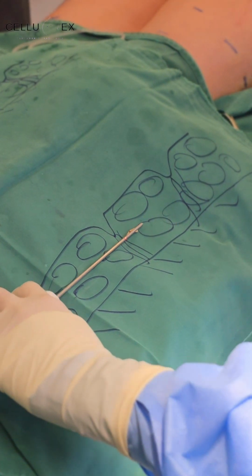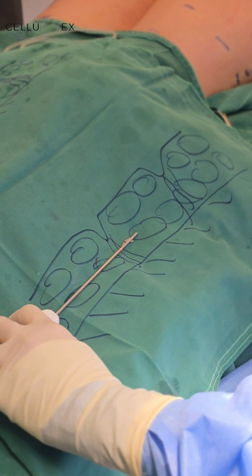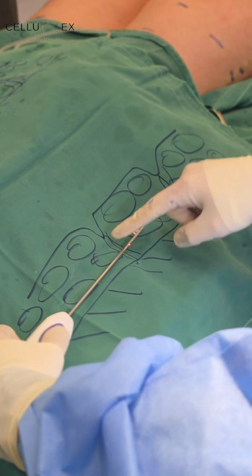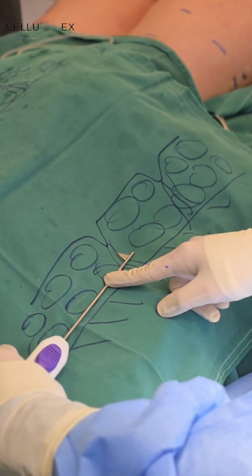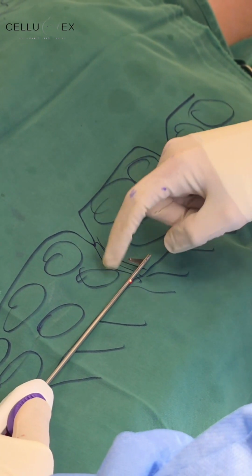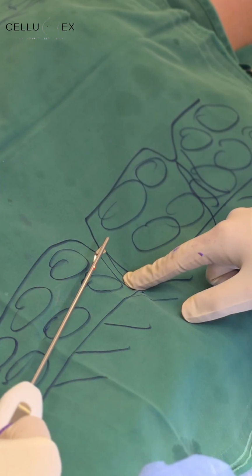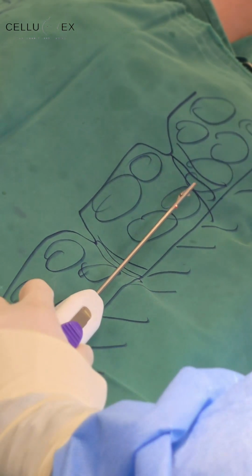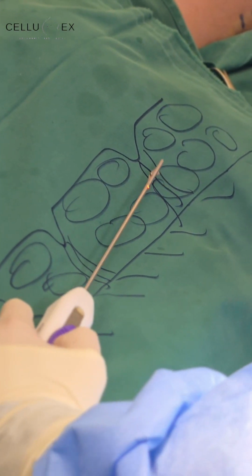Once we go inside here, with the light source below the dimple that is previously marked, you start launching the blade. So, this is a sharp blade. So you go backward, you hold the fibrous septum, and then with another click, you convert it to a blade which starts cutting the fiber. And then once you are sure that you released all of the septums causing the cellulite, you move on and go to the next one, and you do the same procedure to it.